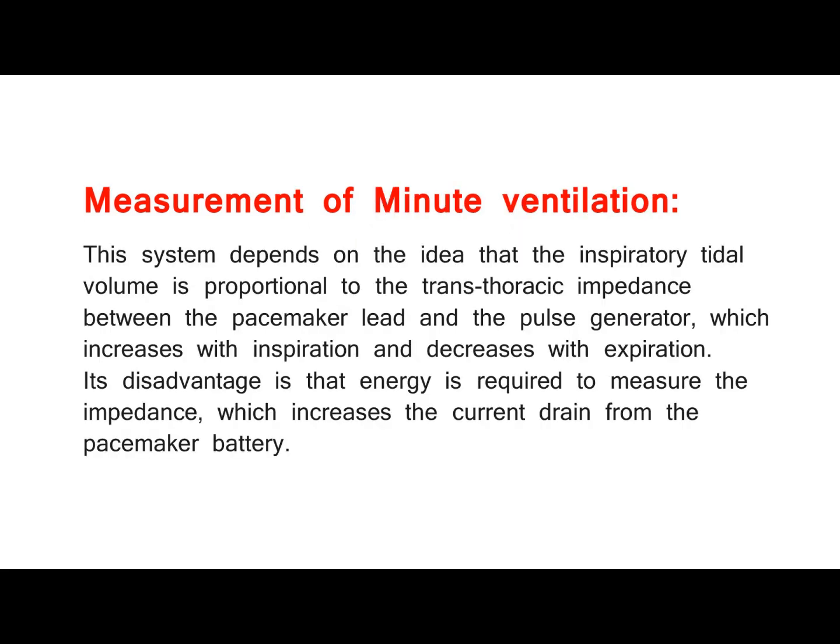Measurement of minute ventilation. This system depends on the idea that the inspiratory tidal volume is proportional to the transthoracic impedance between the pacemaker lead and the pulse generator, which increases with inspiration and decreases with expiration. Its disadvantage is that energy is required to measure the impedance, which increases the current drain from the pacemaker battery.